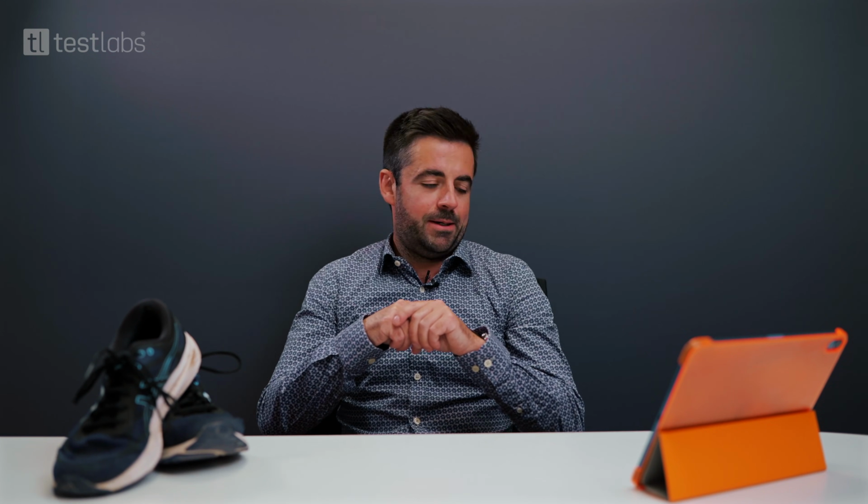The second could be not the design of the packaging, but the choice of materials, adhesives, Tyvek, or even plastics used for the blister part that are not specifically designed for VH2O2. This is something we also learned after a few tests and a few projects. So it was also a learning curve when you start to transfer EO to VH2O2 processes.